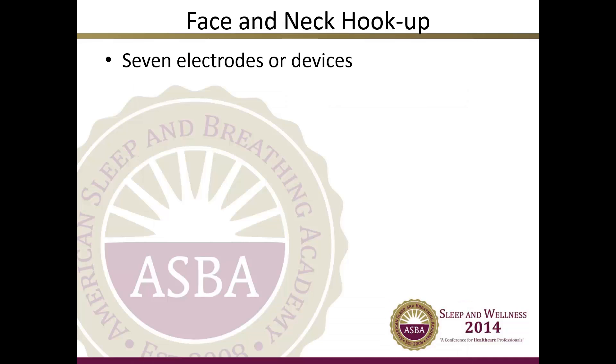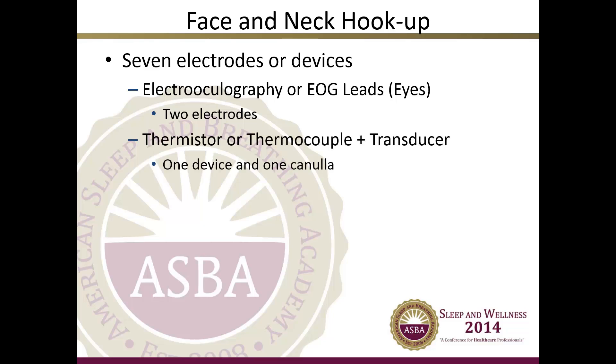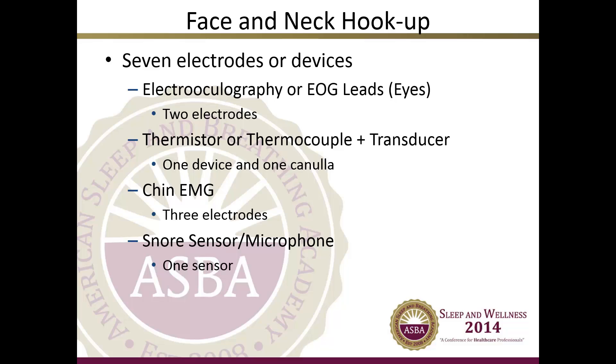The face and neck hookup includes seven electrodes or devices. These include the EOG leads — two electrodes; the thermistor or thermocouple plus transducer — one device and one cannula; the chin EMG — three electrodes; and the snore sensor and microphone — one sensor.